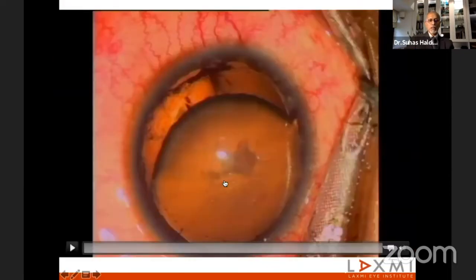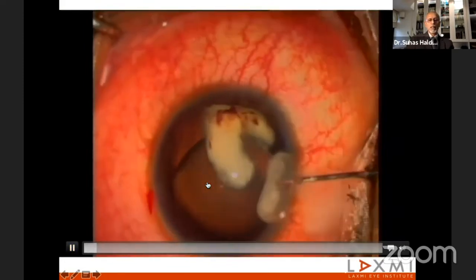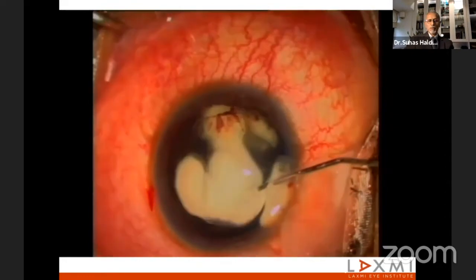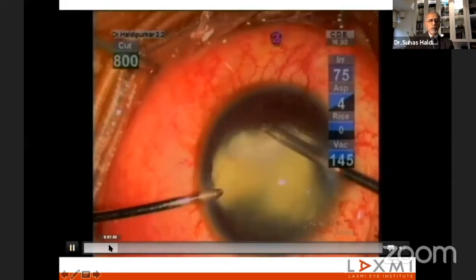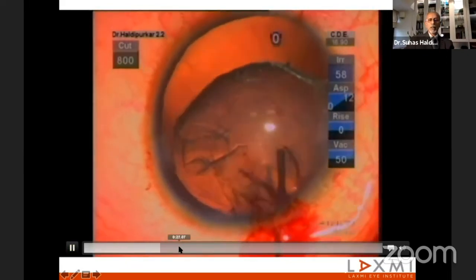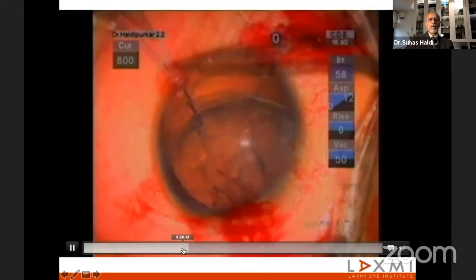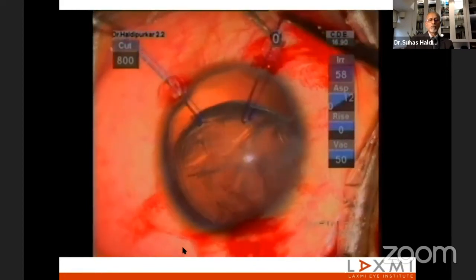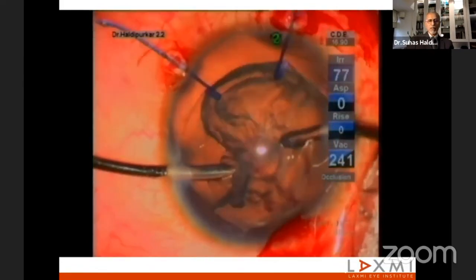Now, this was a case done several years back, maybe 13 years back, when a boy came with a trauma with blood in the AC, blood and vitreous in the AC. So this patient at that time underwent surgery. I decided to put an endocapsular ring, and decided to put Cionni's ring at that time. That time, we didn't have the concept of pupilloplasty for traumatic mydriasis.